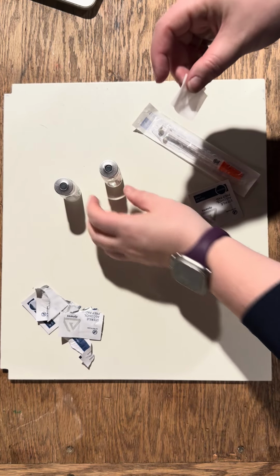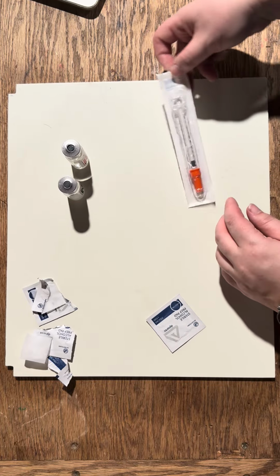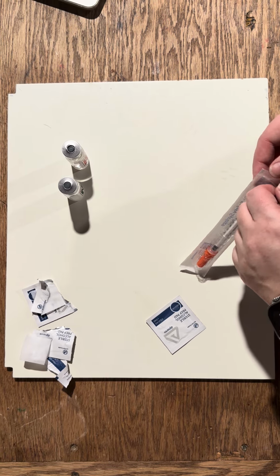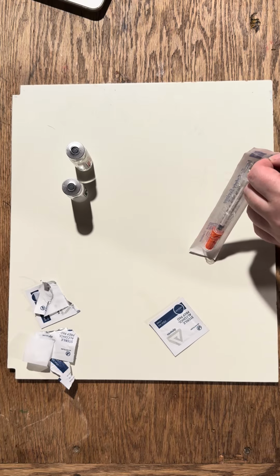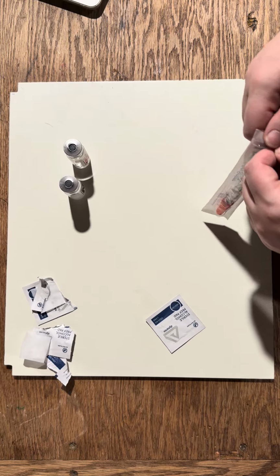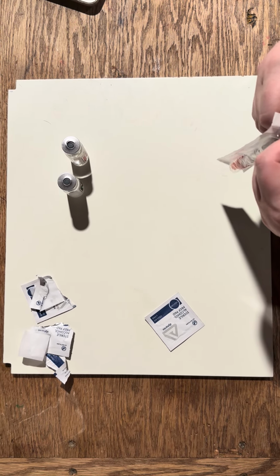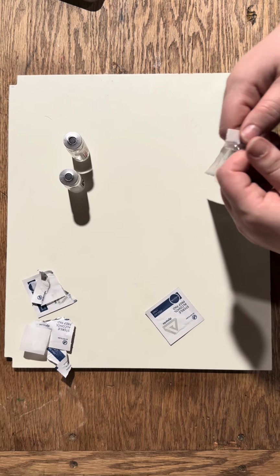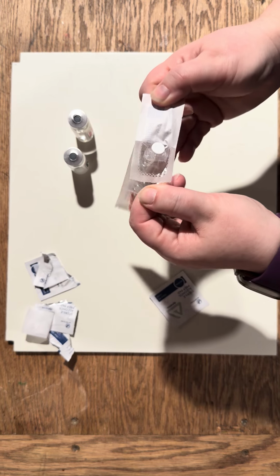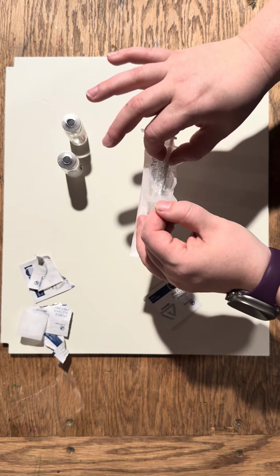Okay. Now that I have made sure both vials are sterile, what is it here in my EMR? I have 6 units of regular insulin and 12 units of cloudy insulin. So I will open my package, making sure not to contaminate.